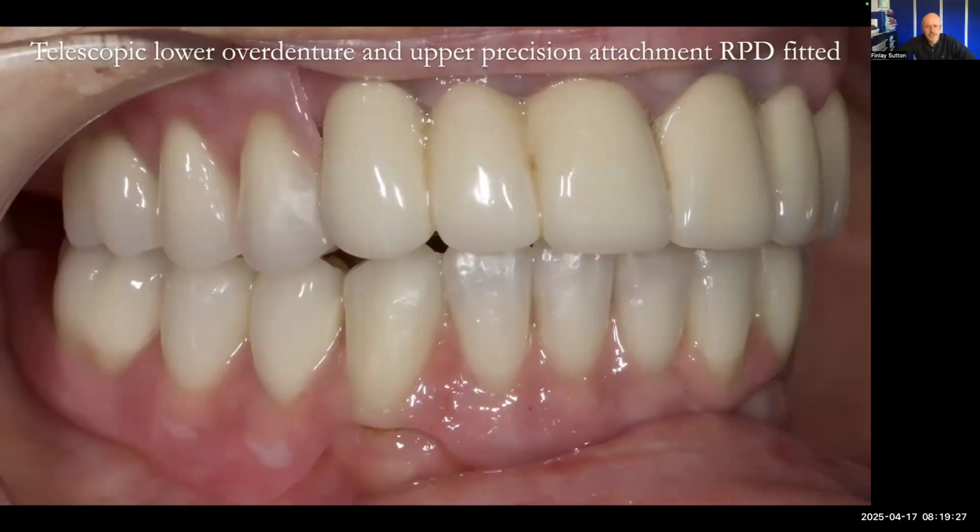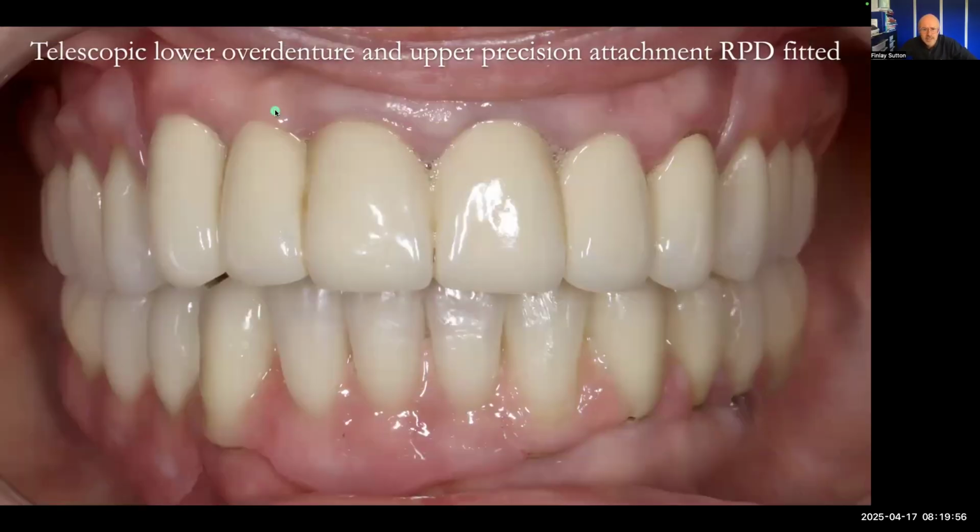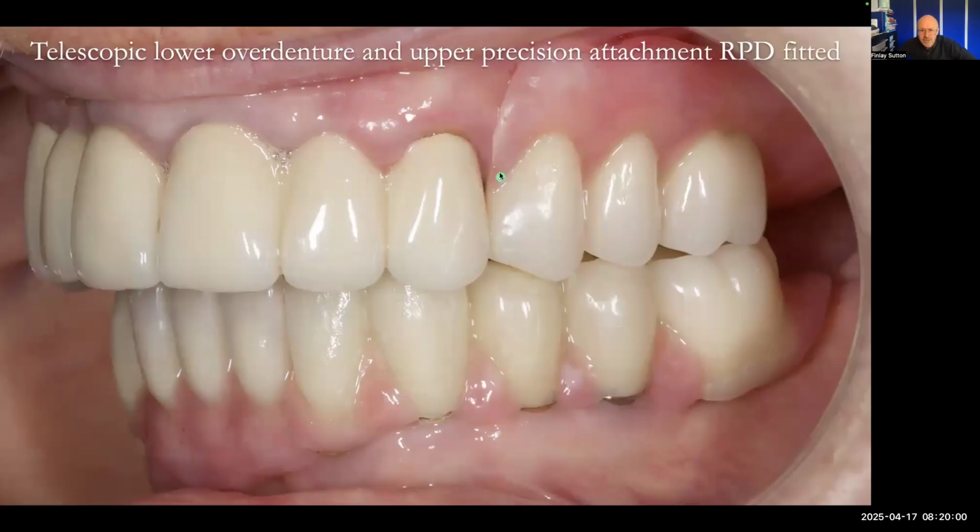There, and this is it finished in place. We've always got these little spaces. Aesthetically, if this was visible when the patient functions, then that's going to be a failure. Not particularly happy about this. This could be better, having no pink there, but just having the white of the tooth extending right up to there and having the pink work starting there. That's what I'd like to improve on that case. Same on this side. I'd prefer if we could just not have pink there, and it'd be all white coming up to there, so it's got a proper root surface sitting into the gum.